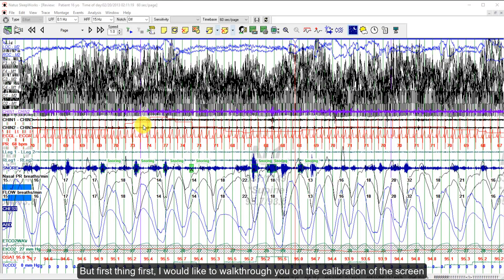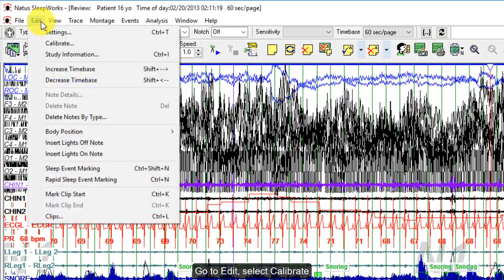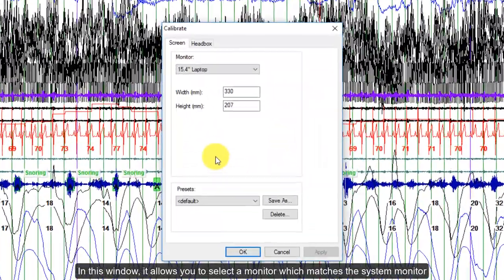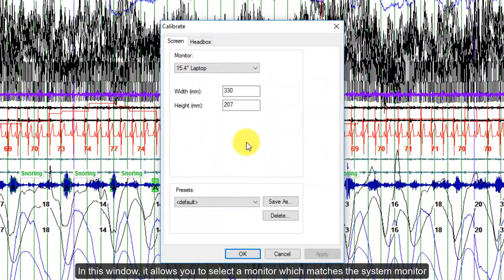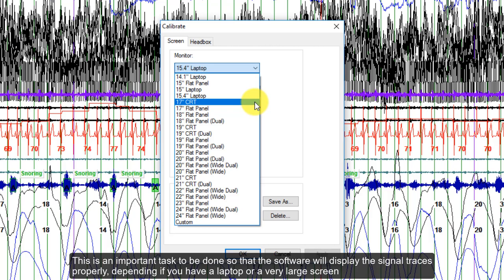First, I would like to walk you through the calibration of the screen. Go to Edit and select Calibrate. In this window, it allows you to select a monitor which matches the system monitor. This is an important task to be done so that the software will display the signal traces properly, depending on whether you have a laptop or a very large screen.